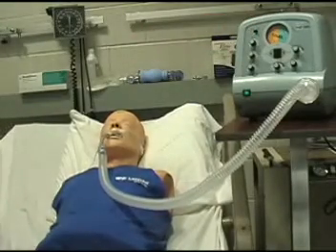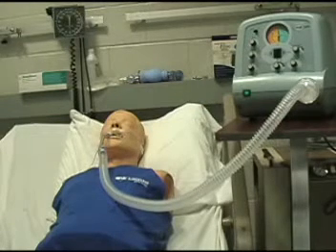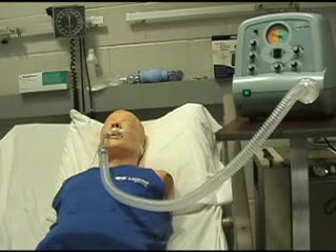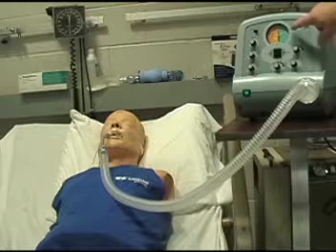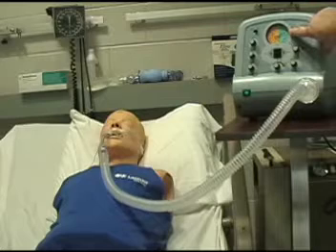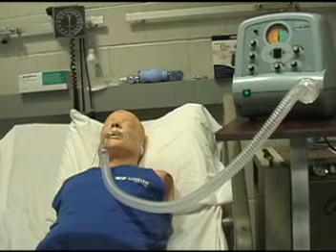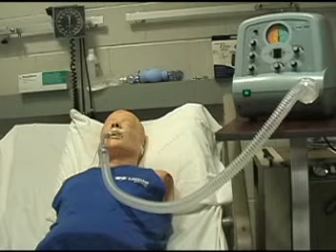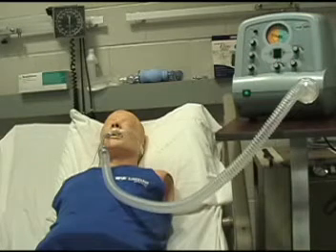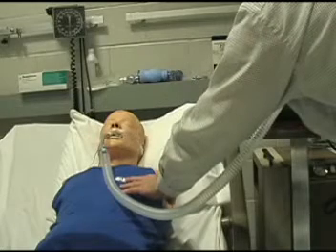It's gone through positive 40, negative 40, now pause. Positive 40, negative 40, pause. Positive 40, negative 40, pause. Positive 40, negative 40. And you can see the chest moving on the positive — it fills up and lets it out.